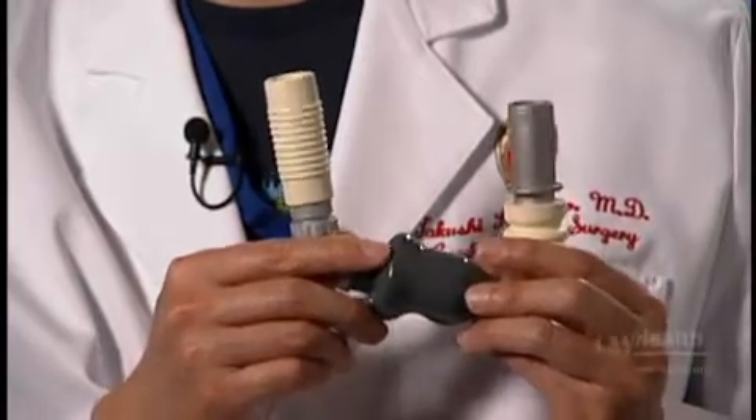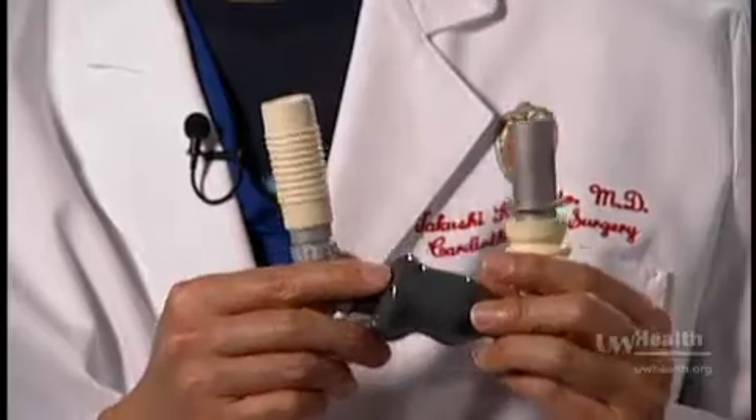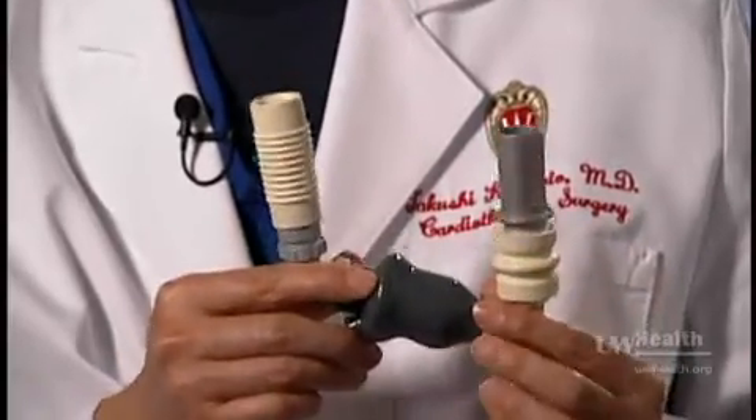This is one of the pumps that we use to help the patient with end stage heart failure, called a left ventricular assist device. This is a device that can assist the heart — it is helping the heart. It does not replace but it helps the heart.